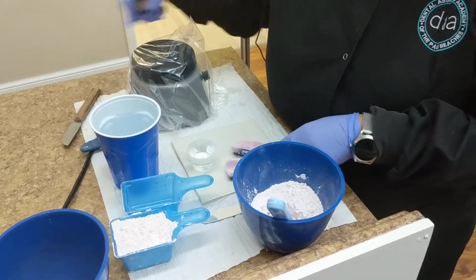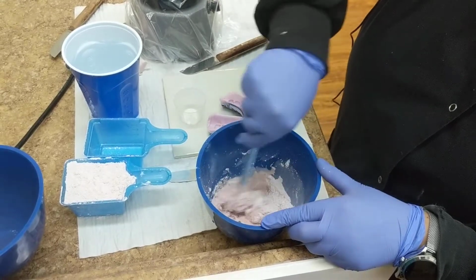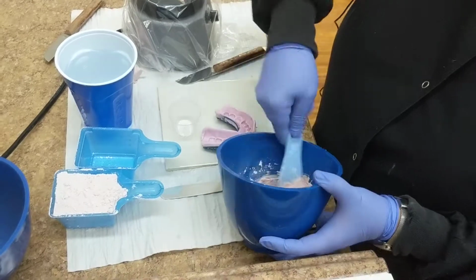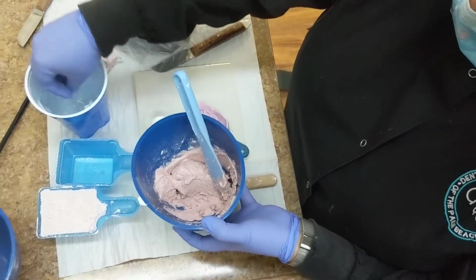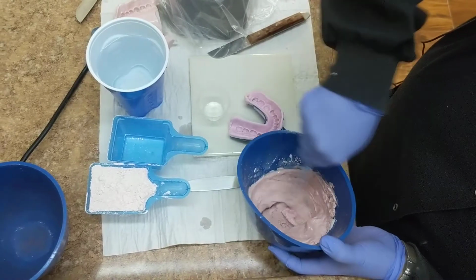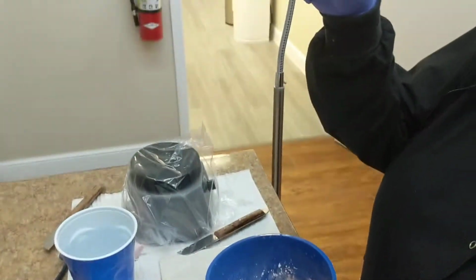So now that that's ready, I'm going to mix the stone. So the stone, if you do the correct measurements, but since you're not going to have a scale, I want you guys to rely on a thick peanut butter consistency. So right now this is kind of thick. I want it a little bit more smooth. A little bit of water goes a long way with this. So I'm just adding a little pinch of water here, so I can get my peanut butter consistency. I like that better. My peanut butter consistency is when it doesn't come down the spatula too easily.